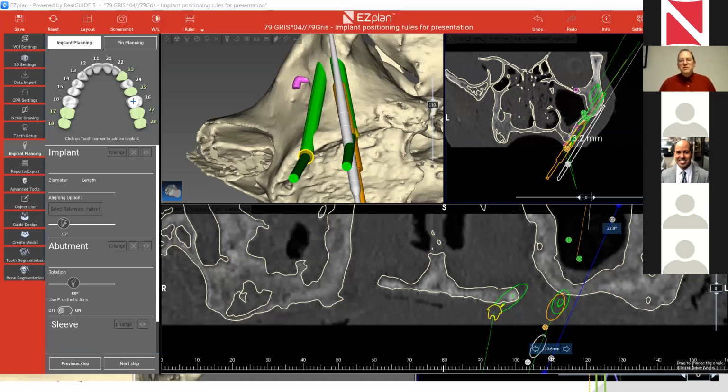Well, the medium and the rough are very close to one another. As a matter of fact, in the new kit, I only left the fine and the coarse. I took the mid out because it's very close to the coarse.